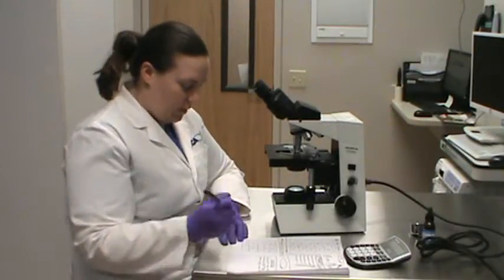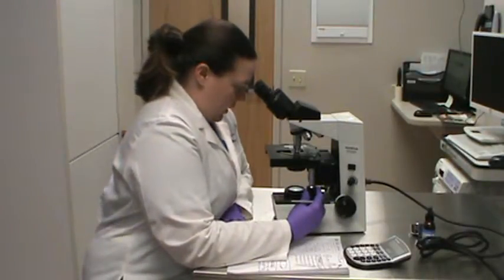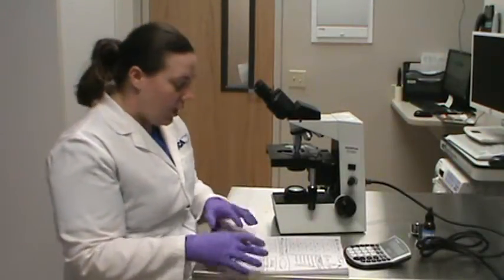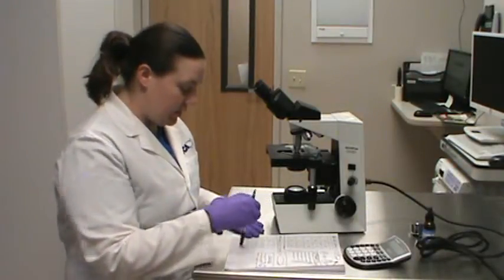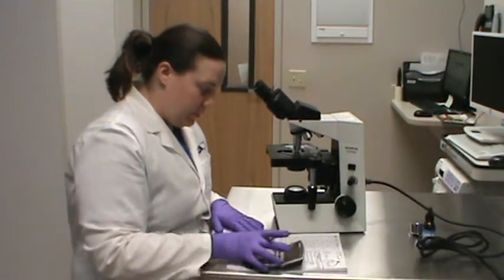4. And then I'm to my last box, which is my 10th field, and we'll see how many platelets we see in there. Three. Okay, so I have all my boxes filled, which means I looked at 10 different fields and counted the platelets in each of those fields. So we're going to add those up.